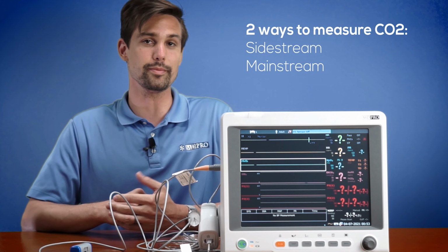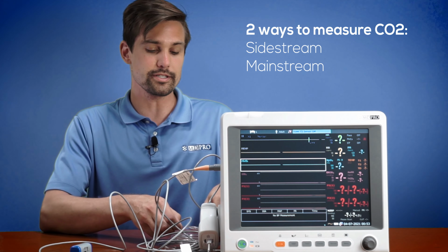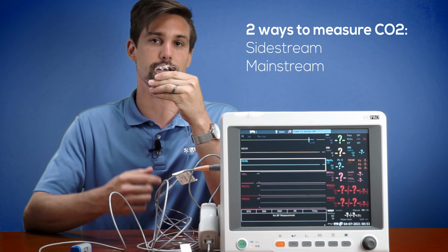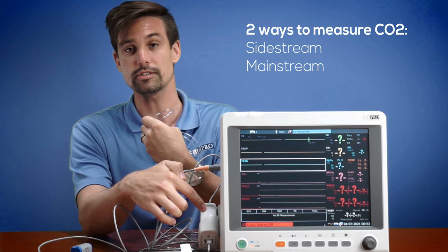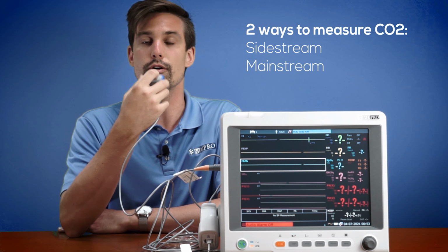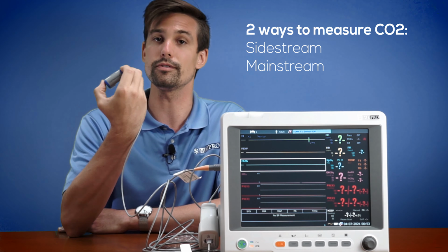So there are two ways to measure CO2, side stream and mainstream. Side stream is typically when a patient has a tube or a nasal cannula right up their nose and measures the expiration that travels down that tube and then to a module off on the side stream. Then there is mainstream, where a module will come out and then connect to an endotracheal tube right at the patient's mouth and get the CO2 readings from the main source, or mainstream.